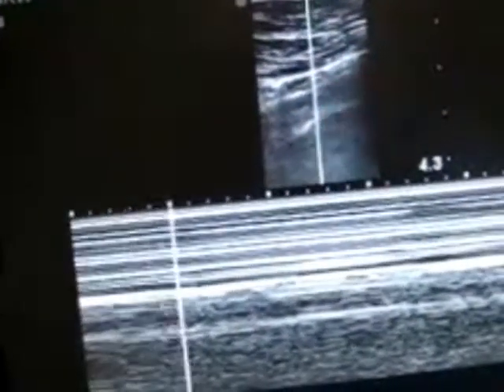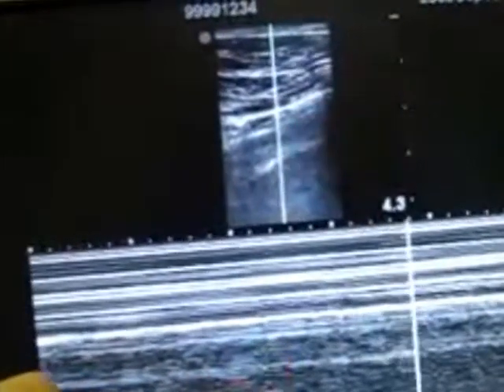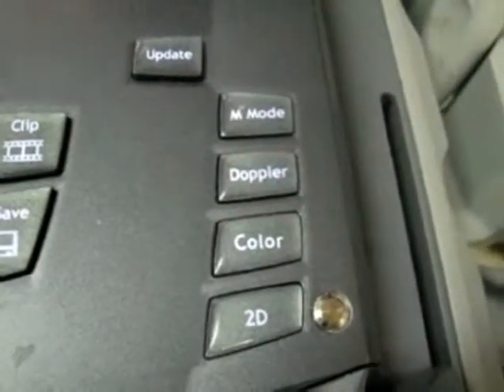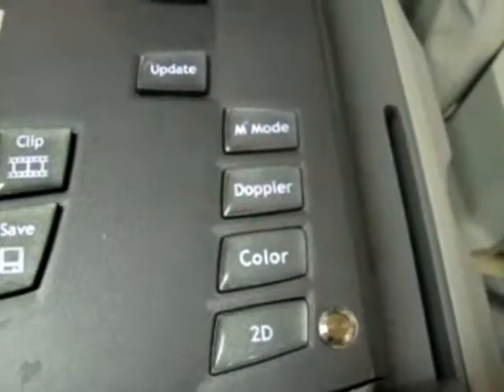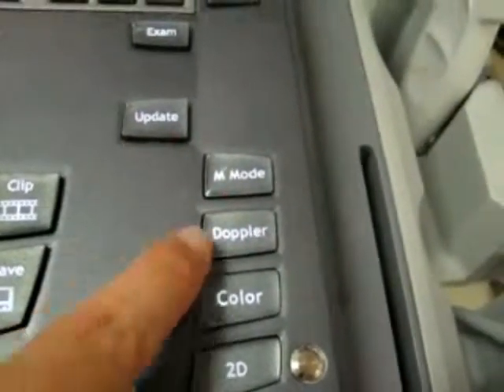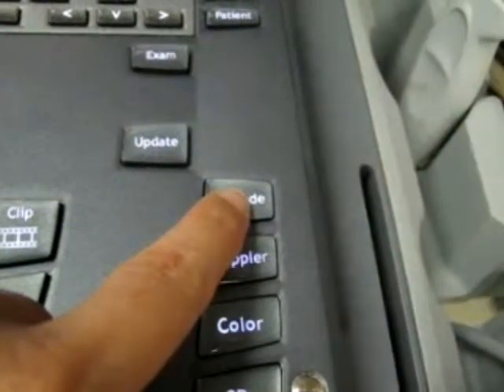With a normal finding, you will have the classic sandy beach appearance, showing horizontal lines in the near field and a sandy appearing area lower down. For evaluation using M-mode — for example, during evaluation for pneumothorax — simply strike the button called M-mode.